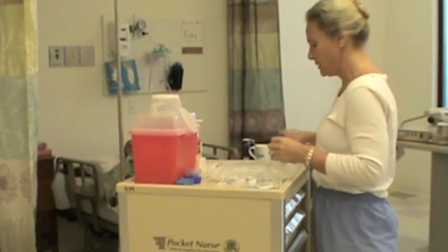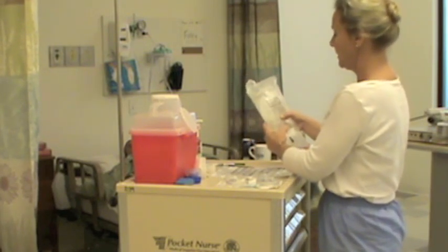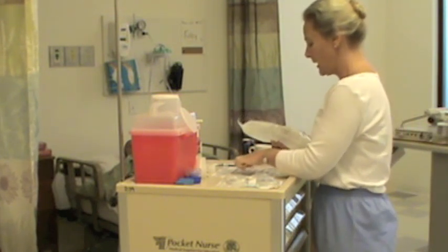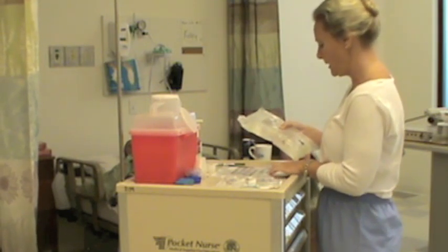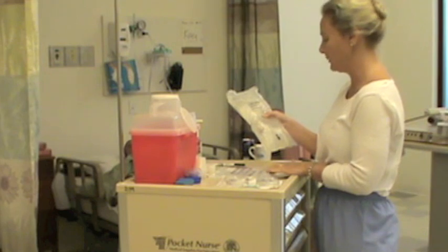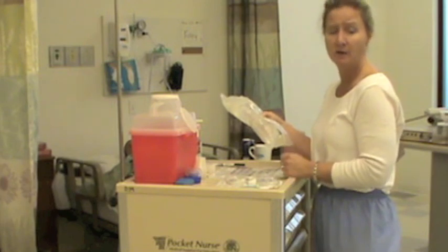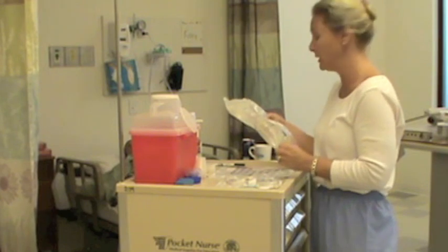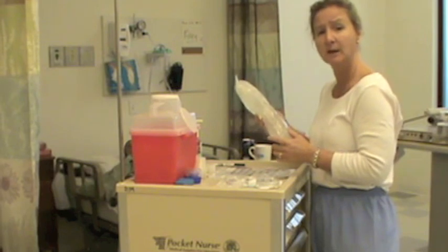The first thing I'm going to do is confirm I have the correct solution. I can see through the bag that it is not expired — November 11th. For Hoshi Ito, I check his medical record number. He's allergic to morphine. I see it is 0.9% sodium chloride, one liter or 1,000 mL to be hung. The rate is 125 mL per hour. I'll need to calculate drops per minute since I'm not using a pump. It's not expired, and it's times 3 liters — this will be his second liter bag.